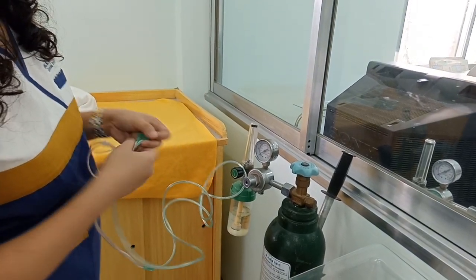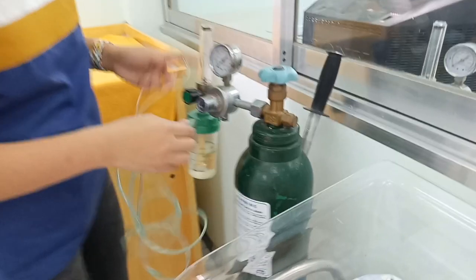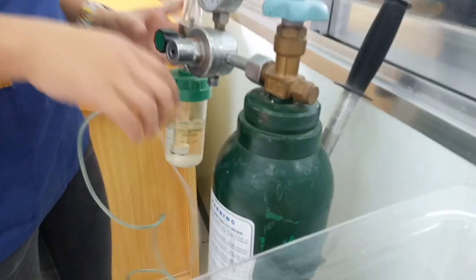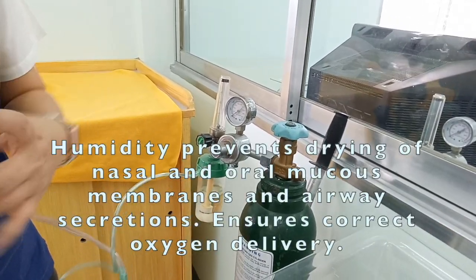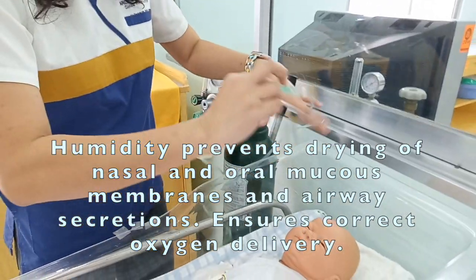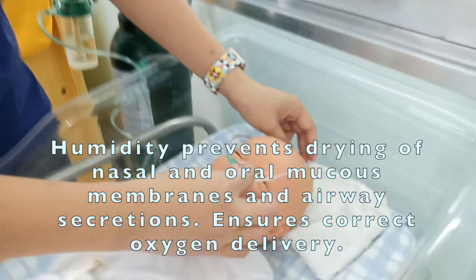Attach to humidified oxygen source or to the humidifier. Then, turn on oxygen to prescribed flow rate, then test flow. Humidity prevents drying of nasal and oral mucous membranes and airway secretions. This also ensures correct oxygen delivery.